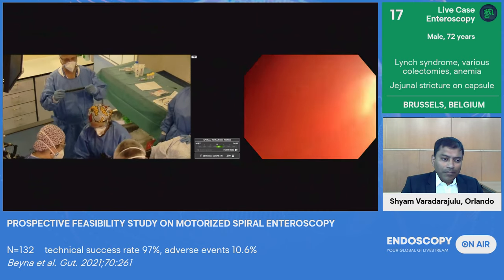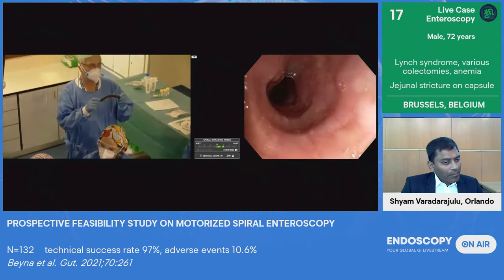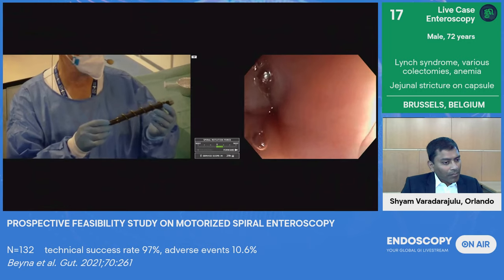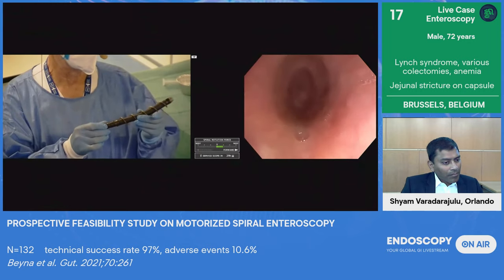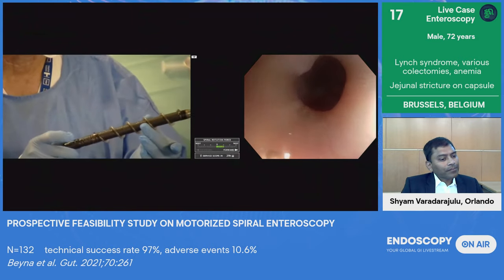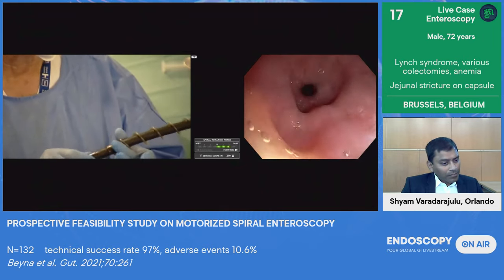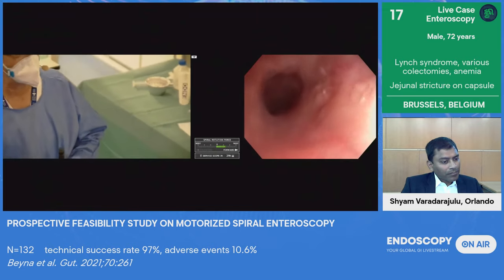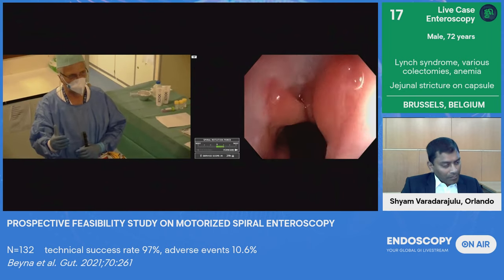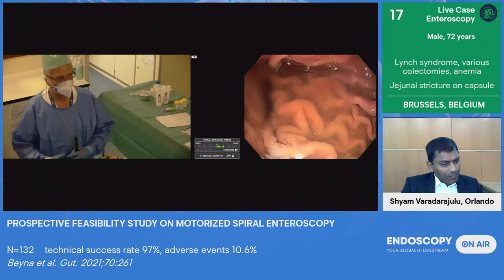So this is an example of the spiral, which is fixed on the endoscope. So these are single-use spirals. You see that the coil is very flexible. The idea is to be as atraumatic as possible while keeping the force to help the advancement of the tube. And of course, the big difference with any other device is that the force is applied from the tip of the endoscope or from the distal part of the endoscope. So the endoscope will be pulled inside the GI tract.